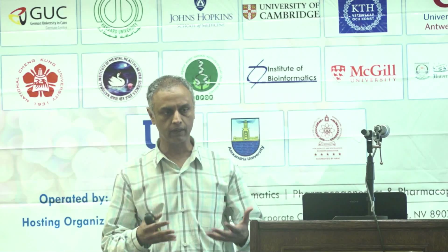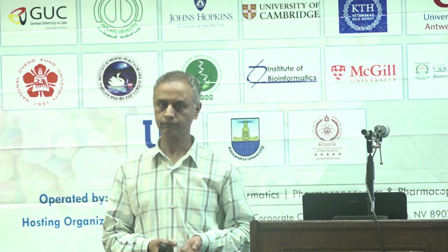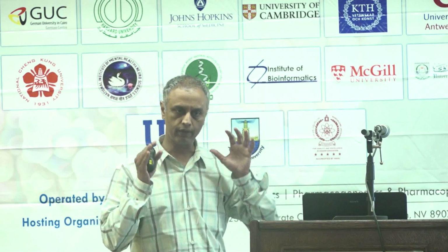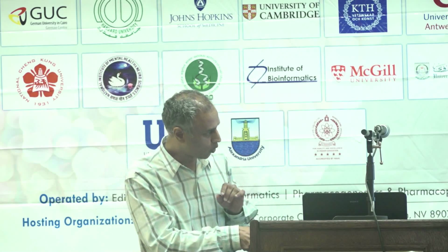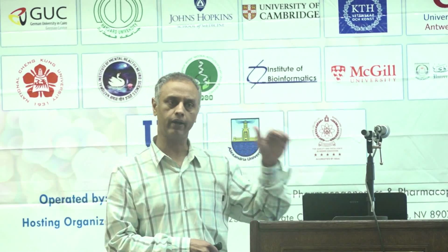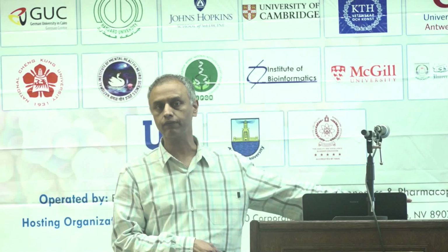Most clinicians, I think it's fair to say, do not understand mass spectrometry. So they have to be basically told what is a positive identification. So there's a lot of mumbo-jumbo that goes into converting the answers from this matching to a yes or no answer, whether or not you have identified an organism, and the companies have successfully done that.